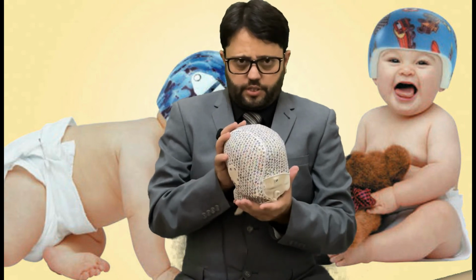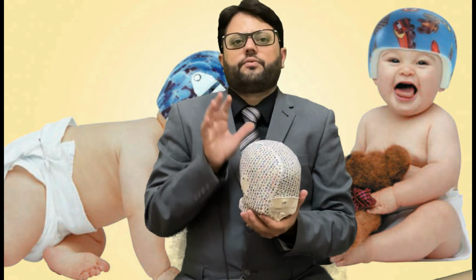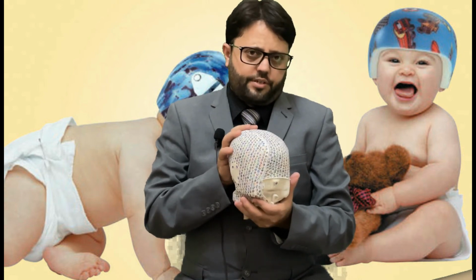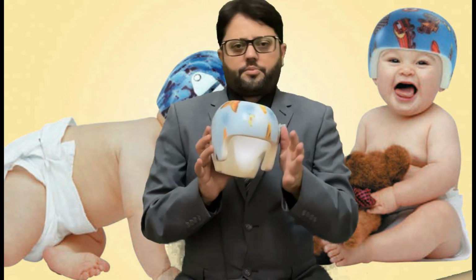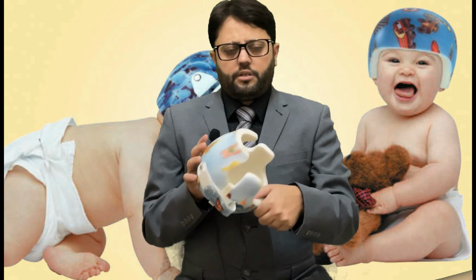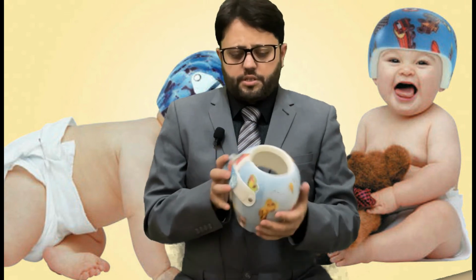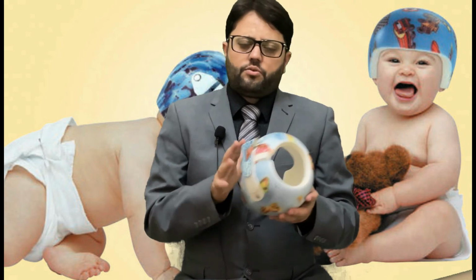Once we have done this, it will take some time for fabrication. Once the fabrication is done, we do a fitting. This is the cranial remolding orthosis. It is made from plastic, and inside there is a medicated foam, very soft inside. When we are here for fitting, we need to trim it, cut it, and grind whatever is required as per the need and as per the deformity.